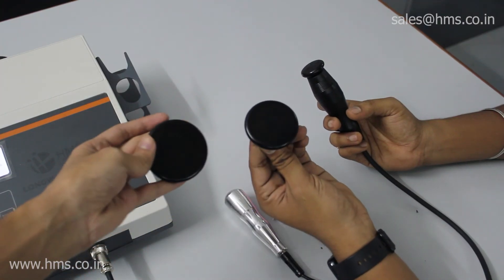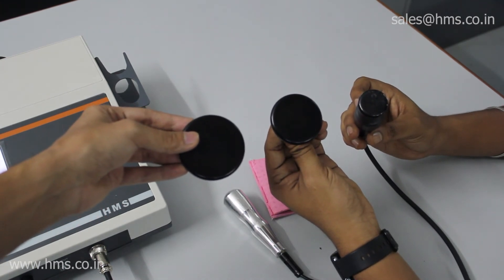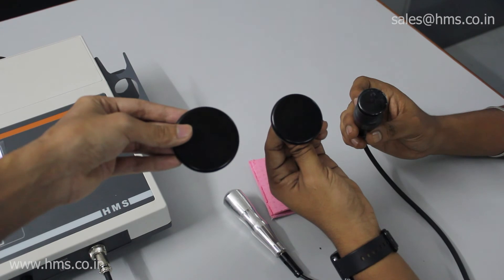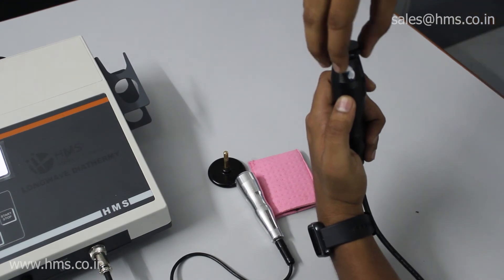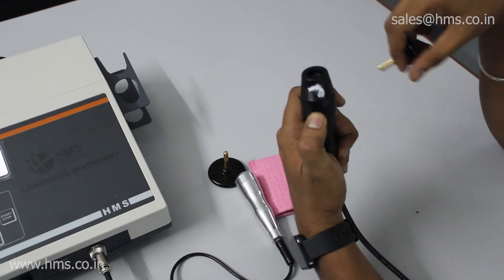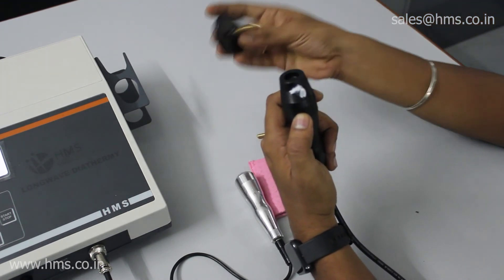The bigger applicators can be used when you want to give treatment on a larger surface area. Removing the applicator from the probe is also very simple — you just pull it up with some force and it comes out. You can then interchange the applicators as needed. It's very simple to use.